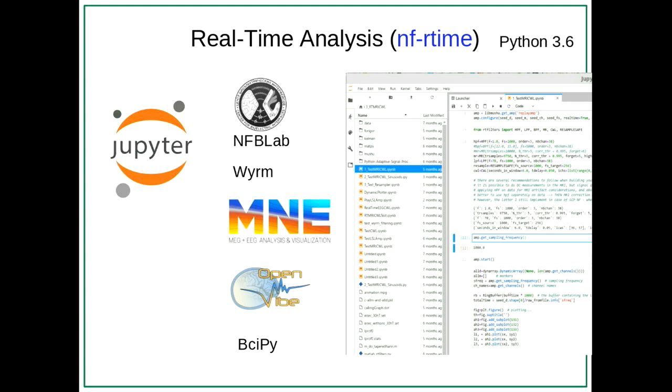Then the real-time environment. This runs on the real-time computer. It's Python 3. I use the Jupyter notebook because it allows me to use the cells to document the experiment, to explain what is going on, what the experimenter needs to be doing. It allows me to start the stimulation computer, to do real-time analysis, to start and stop the camera that I also have. And it's a really convenient way to iteratively go through your experiment. If something needs to be redone, you can just redo it again.